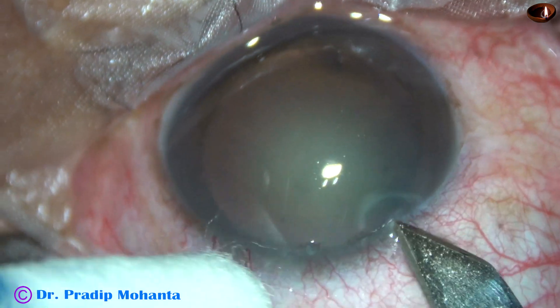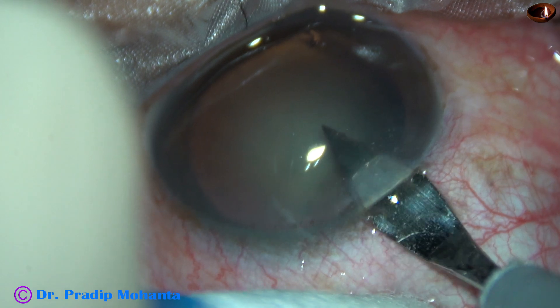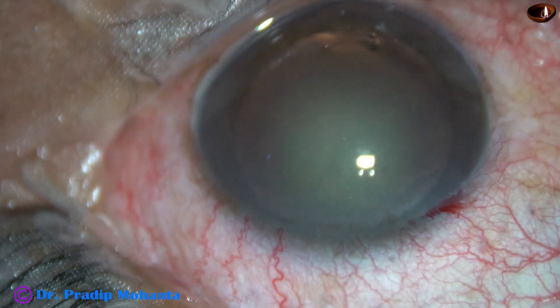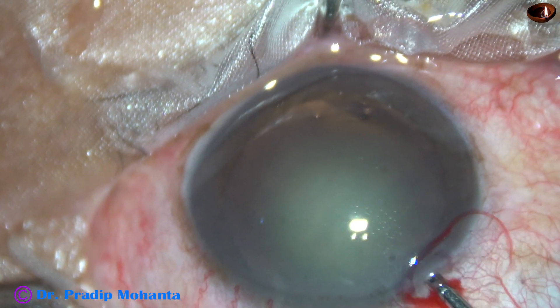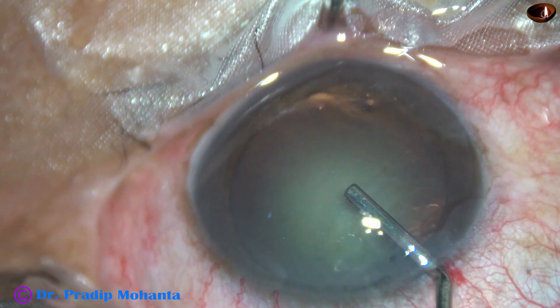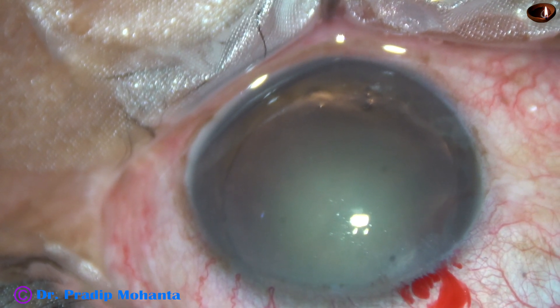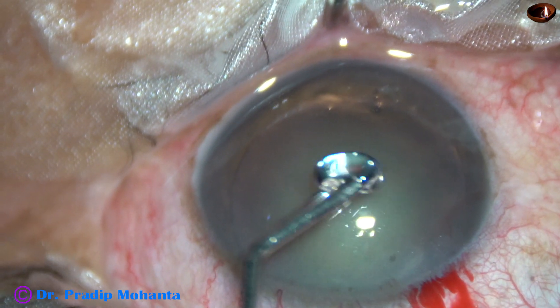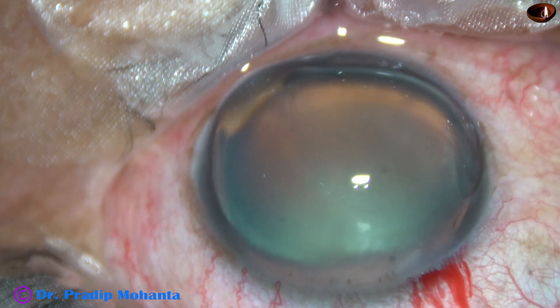This is the main incision with a 2.8 mm steel keratome on the posterior aspect of the limbus. The anterior chamber is now being filled up with 2% HPMC, which is also applied over the corneal epithelium for better visibility.